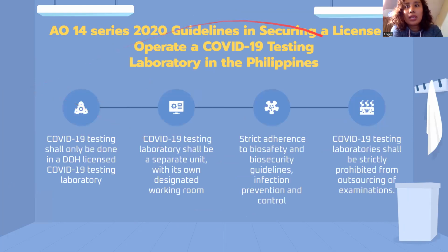My basis for this discussion is Administrative Order 14 Series of 2020. This is a law, guys. I did not invent this, okay? So we have a Filipino guideline, based on WHO recommendations, on the requirements to be able to operate a COVID-19 lab. I picked only a few of them.